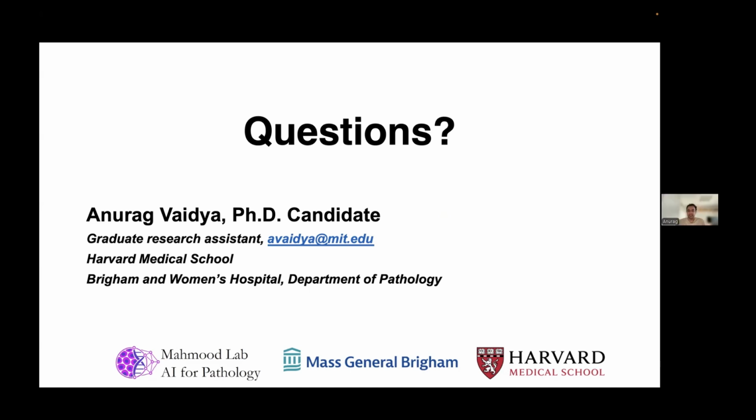Yeah, that's a very good observation, and I have a couple of thoughts that I would love to share. First of all, I think C index is a metric that we have really invented to compare different models. And the C index, in my opinion, doesn't carry a lot of clinical implications. What carries a lot of importance in the clinic are the Kaplan-Meier curves and how you can stratify the patients into different risk groups. But I completely agree with you that a C index of around 0.6 is not very robust.